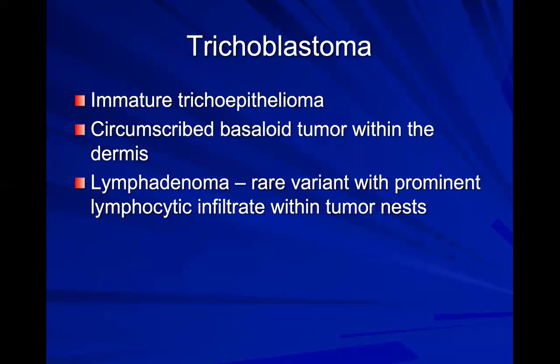All right, so what's a trichoblastoma? Well, a trichoepithelioma is sort of like a subcategory of a trichoblastoma. This is like the most immature type of follicular basaloid-based neoplasm that you get to before you kind of transition to carcinoma. And a lot of this was determined by clinical behavior. And so we'll learn the features here, and that will be kind of the last edge before you hit cancer.